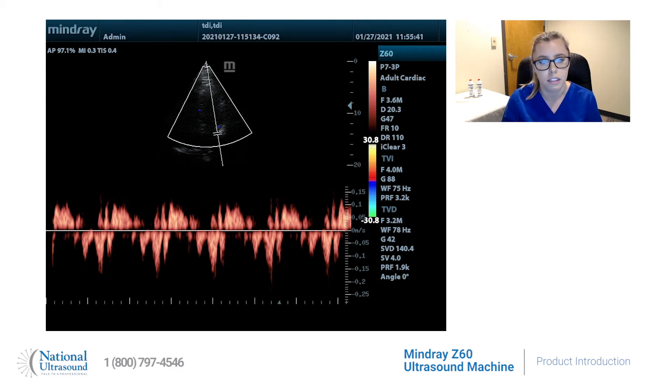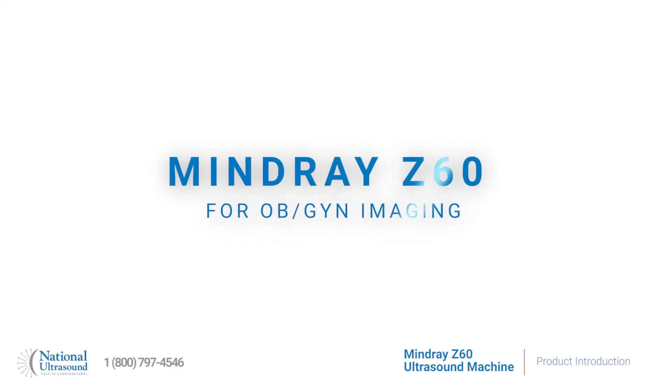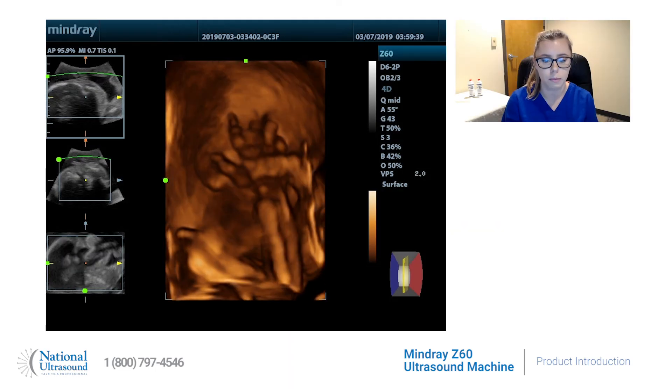The Z60 is a powerful solution for OB-GYN imaging with curved linear, transvaginal, and 4D volume probes available. It is Mindray's exclusive portable system with OB-GYN smart features including 4D real-time imaging.